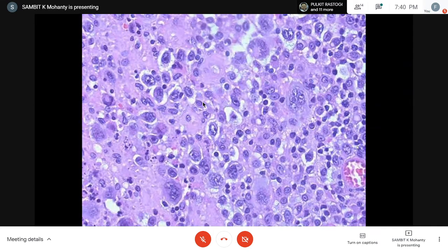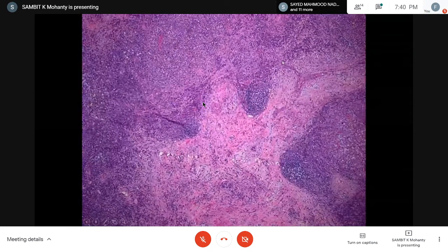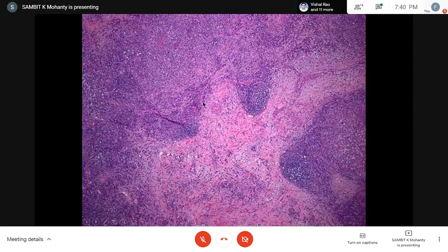As compared to the last case, the number of these uninucleated, binucleated, and multinucleated, ugly-looking bigger cells are a lot. And we have some lymphocytes. What is important? When I was looking at that lymph node, which was an old case, I saw some of these follicles. Like this one is one, and sorry for this scoring mark. And there is another one. There's a fold there. And there is another one. And this is the nodule with those large cells and polymorphic background.